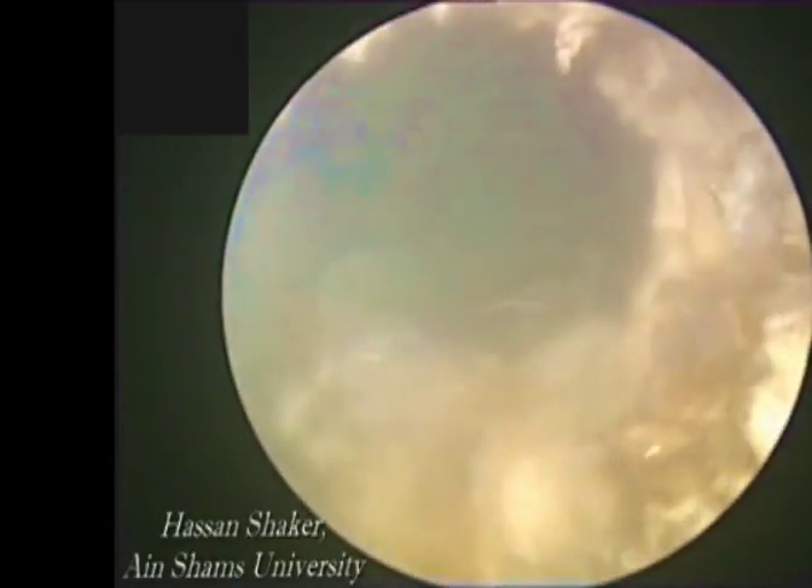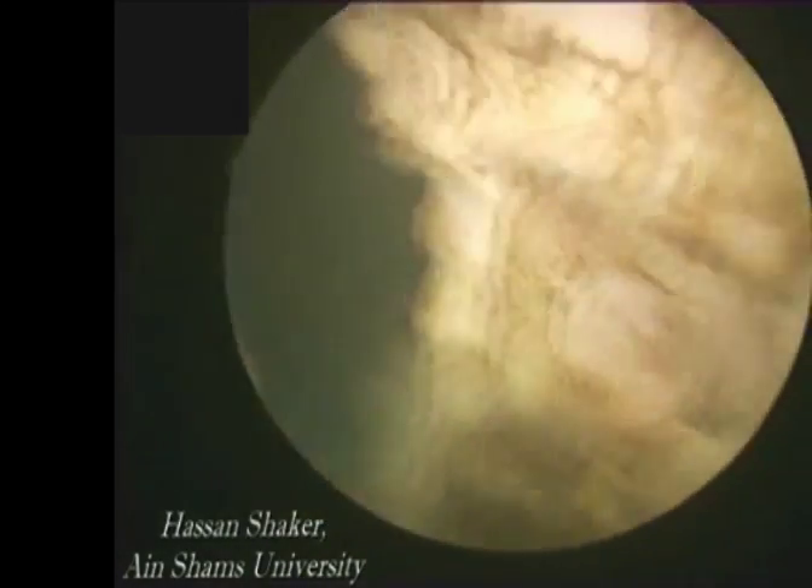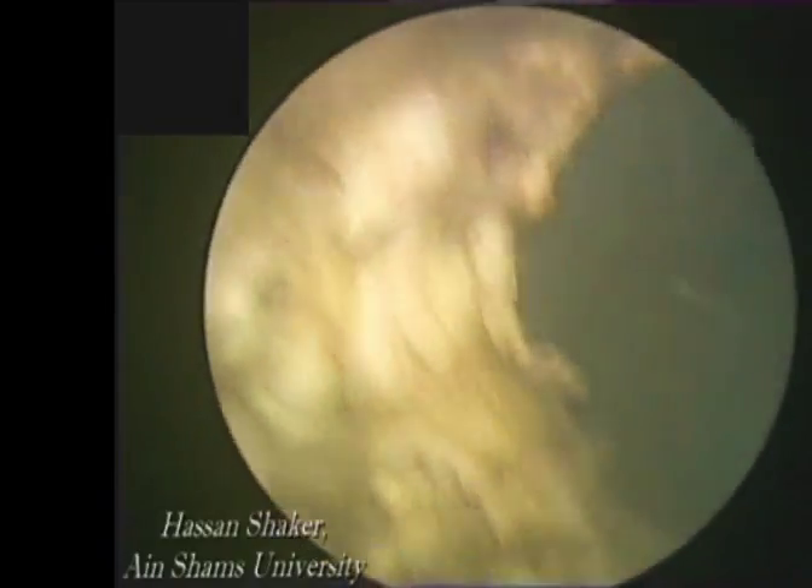This is the final view after ablating the prostate. The surgical capsule is easily identifiable.